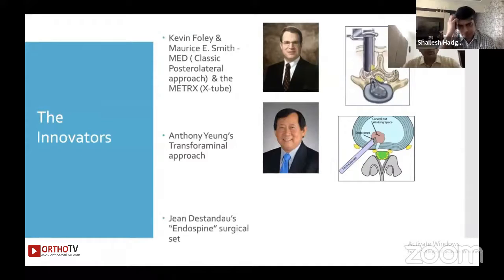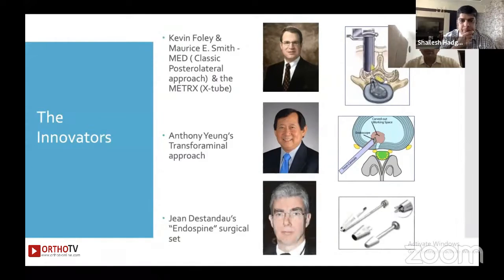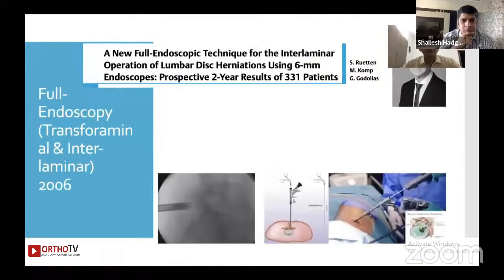And then Destandau developed the Endospine surgical set, which is quite popular among the neurosurgical community. Subsequent to that, Sebastian Ruetten and Martin Komp developed the full endoscopic technique for the interlaminar surgery for lumbar disc herniations, as well as the transforaminal.